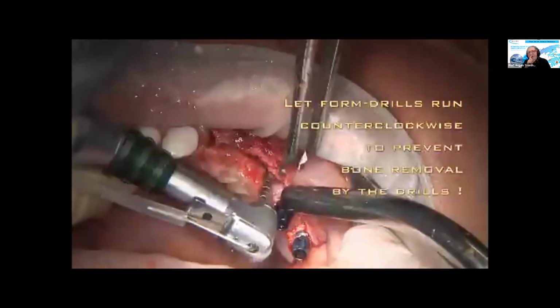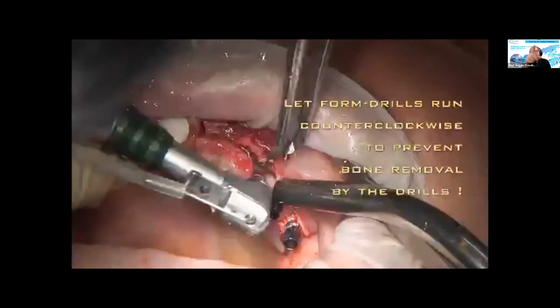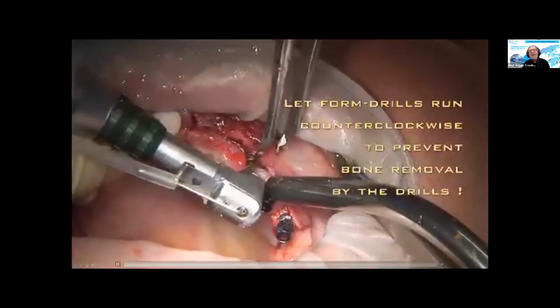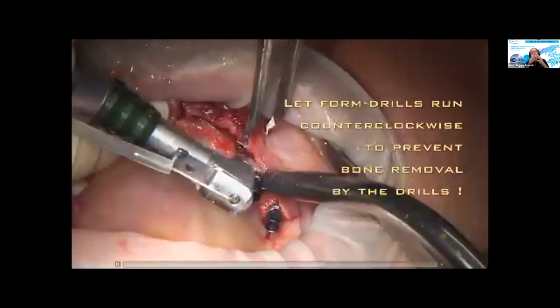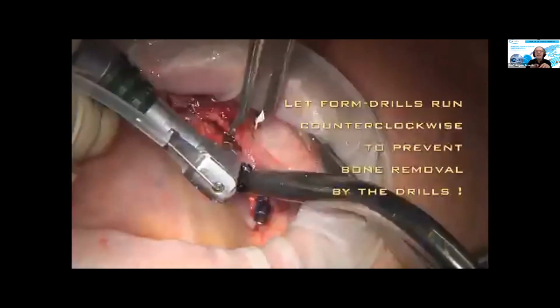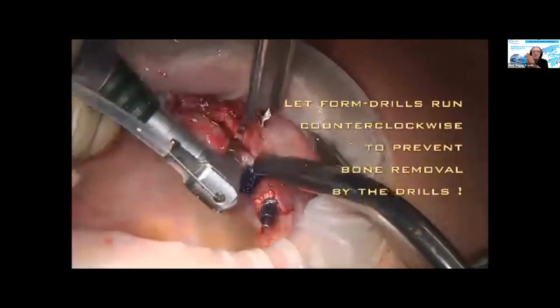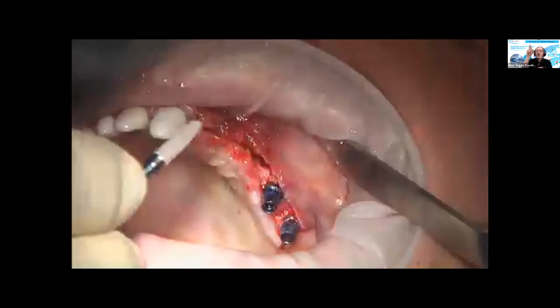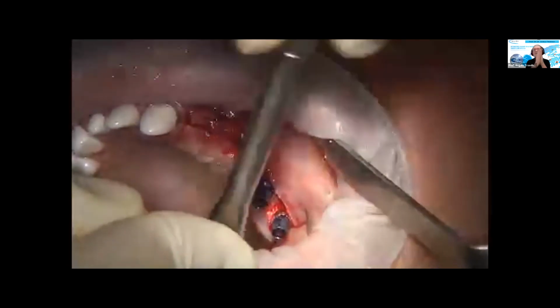So it's very important, especially with a very, very narrow alveolar crest, you will now ask yourself, but why is this drill so shuddering? Why is it not running smoothly? It's simply because I use it counterclockwise. This is so important. You have a narrow alveolar crest. You have to do the drilling for the implant. If you do it clockwise, drills remove bone. But this is what we are not allowed to do. We do not have to remove bone.